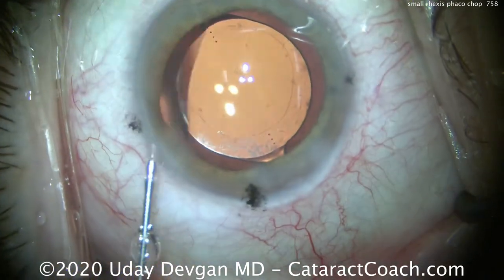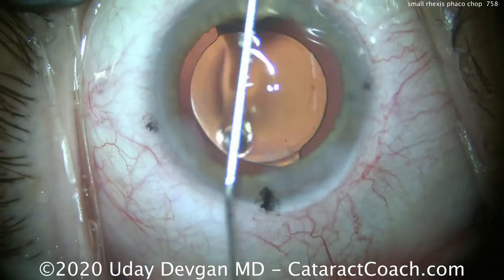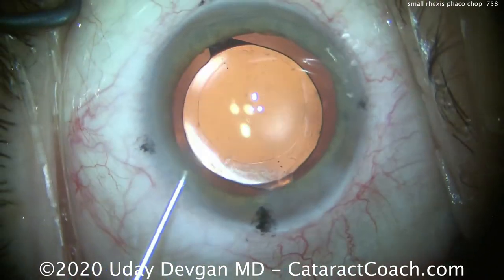So we're going to take out that last little nuclear fragment, get this lens beautifully centered, and we'll call this done.